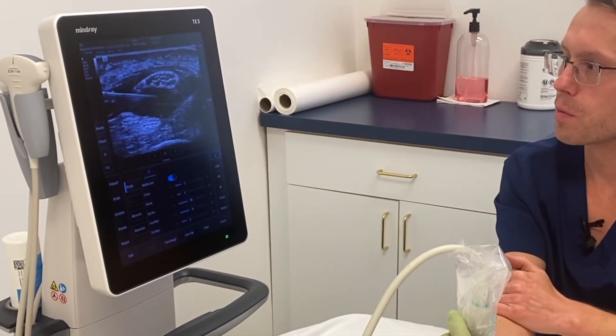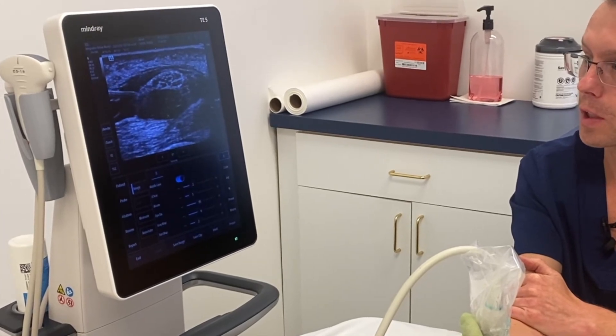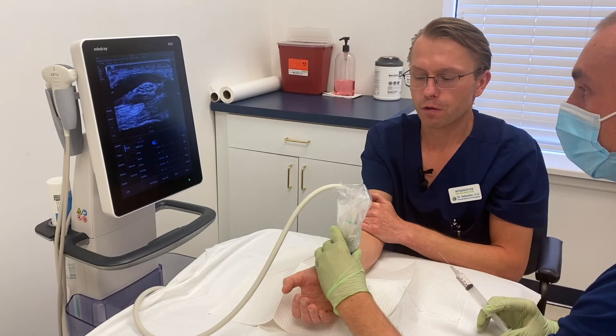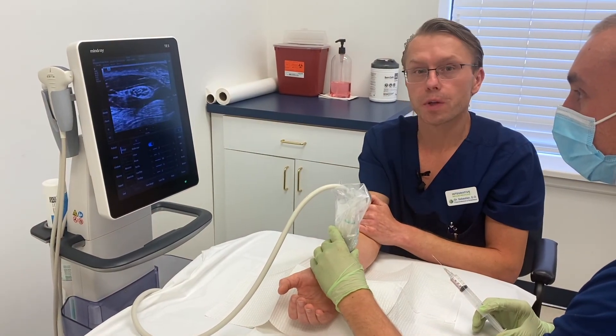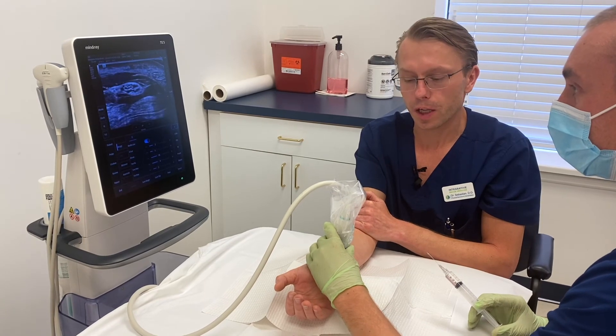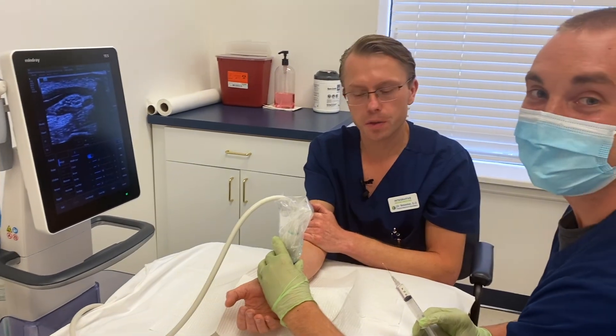The nerve has been released — the tension on the nerve has been released and the solution has been injected all around. The nerve has been released with the dextrose solution, which will help the nerve heal. It will also allow the nerve to start functioning better and take away the carpal tunnel symptoms.